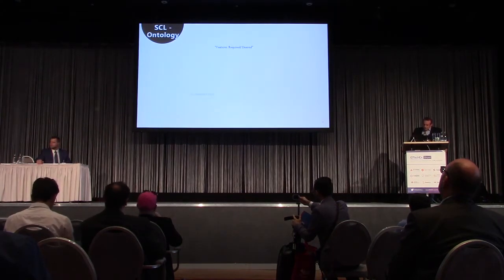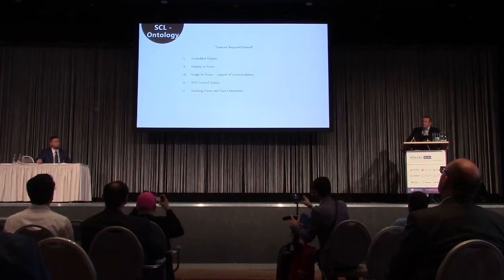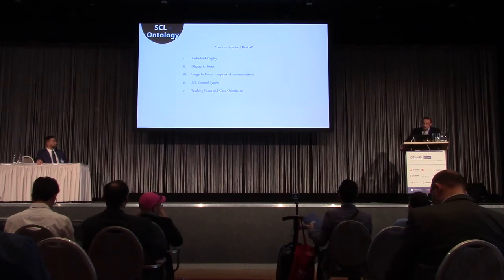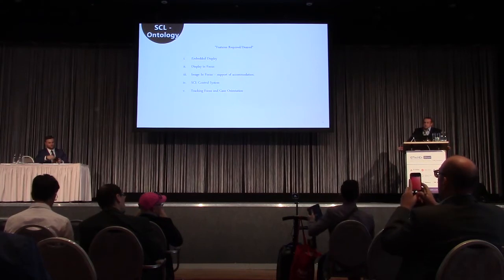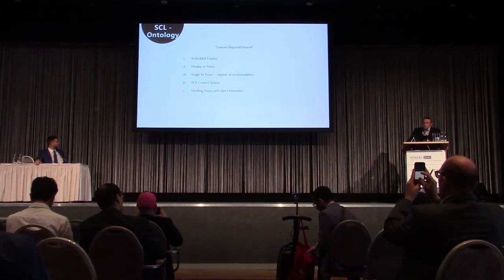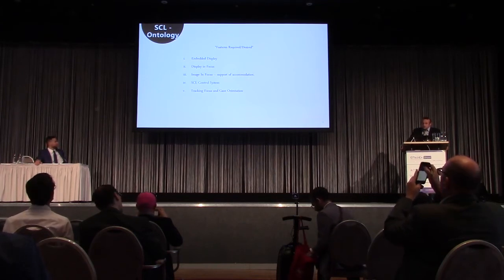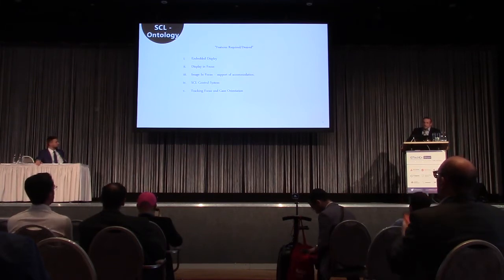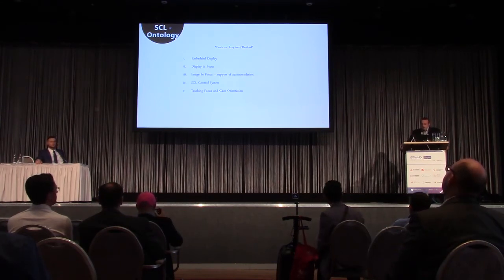Now, to build a fully functional and operational smart contact lens capable of executing AR and VR applications, we need to achieve several milestones. One is we need to embed display, that's obvious. Display needs to project imagery onto the retina of our eye in focus. Now the image display needs to be refocusable and accommodatable. And I'm going to spend some time today talking about this particular issue.